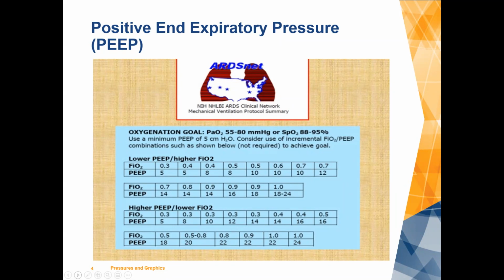And we found that we were increasing the PEEP. Once the patient came up and was stabilized, we found that we were increasing it from 5 to 8, 5 to 9, 5 to 10. And we found out that probably a third of our VAEs, which are now reportable, were attributable to that phenomenon, going from 5 to 8 or higher than that.